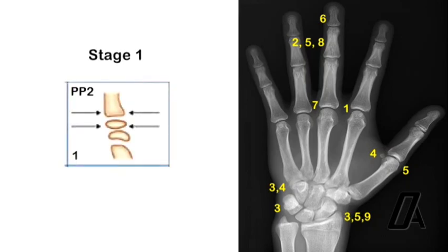In stage one, the epiphysis of the proximal phalanx of the index finger has the same width as the diaphysis. This stage occurs approximately three years before the peak of the pubertal growth spurt.